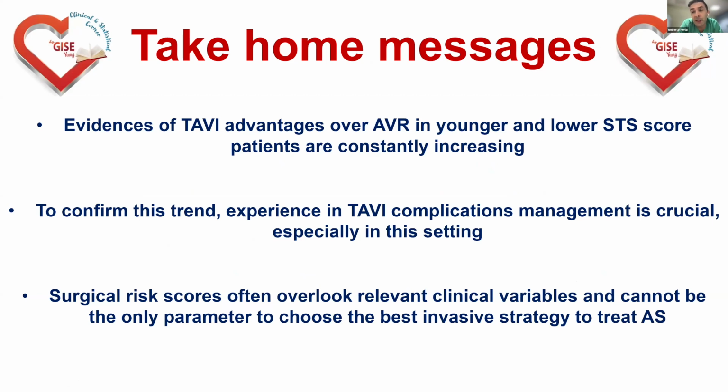Which sometimes is something that you can fix by just retrieving your system without so much trouble. But in your case, you had trouble because the balloon changed its angle compared to the main axis of the introducer sheath. So it's something that you could have to manage. There are many different techniques. I don't want to be technical in this field.